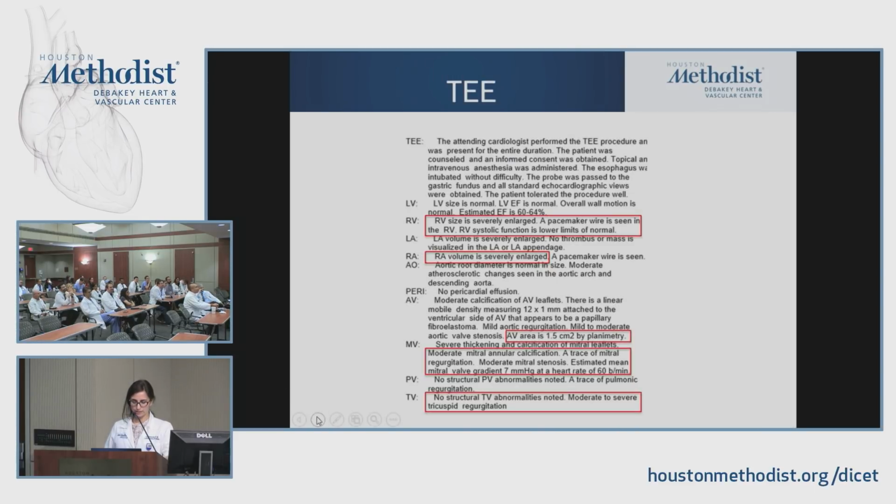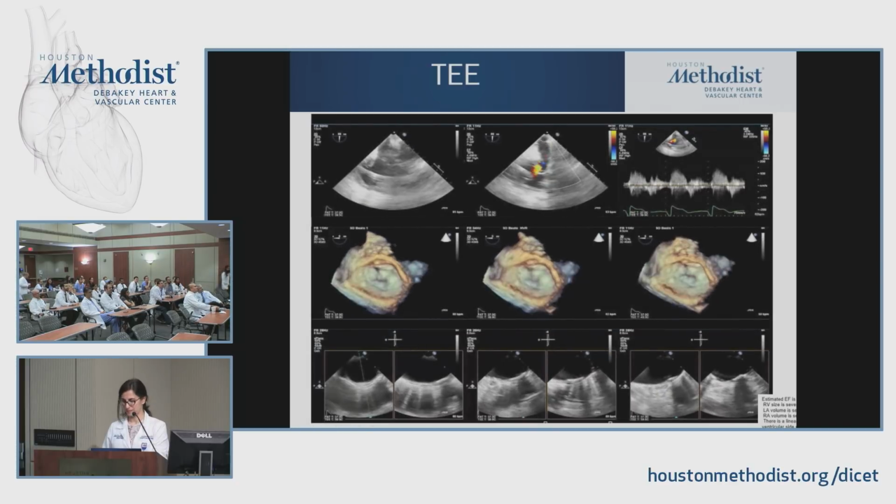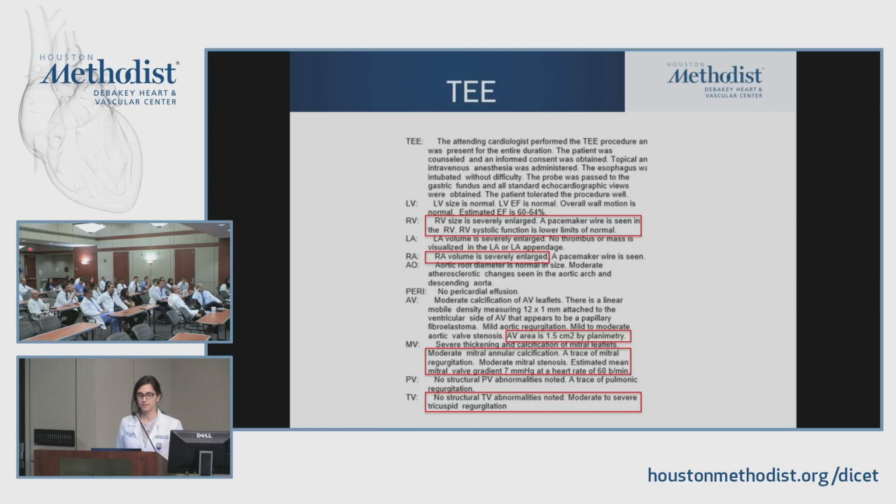This is the 3D of the mitral valve. Okay, so what do we think of this before we see the final report? Just a general consensus, Man. What do you think? I think anatomically and by the majority of the hemodynamics, there's severe MS, and like Mohammed is saying, with significant reduced forward flow caused by the significant TR, the mean gradient will be falsely lower. Okay, like Dr. Pasha said.